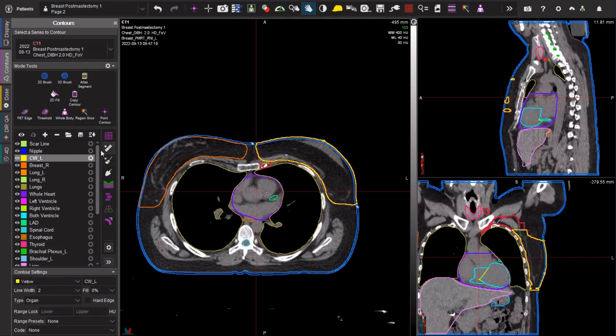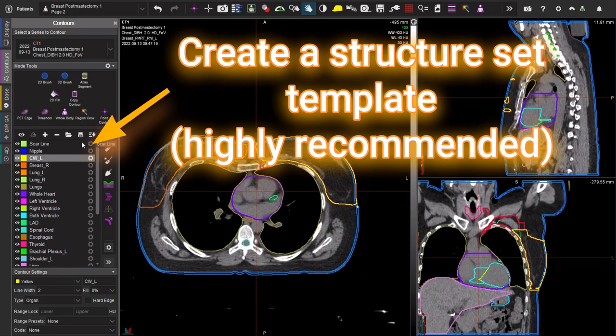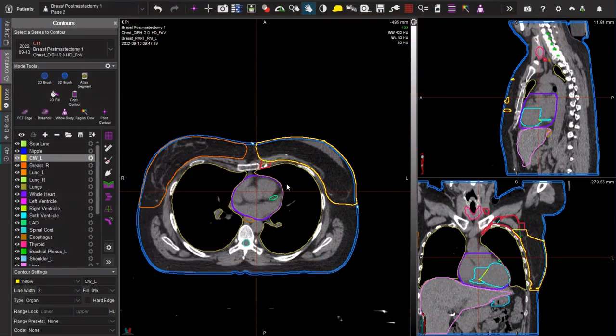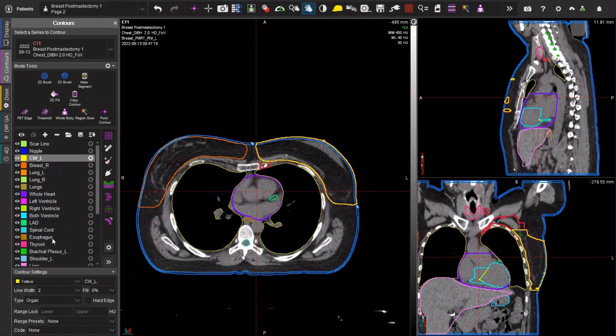Notice here on the left I have included my structure set template. I really do recommend that you create an individual structure set template for breast RNI cases, so every breast RNI case you're going to have the same structures ready for you to contour. There are a lot of structures and it's easy to lose track. It can also be slow and cumbersome if they're not organized in a nice way and you're hopping up and down instead of going through a nice steady checklist.